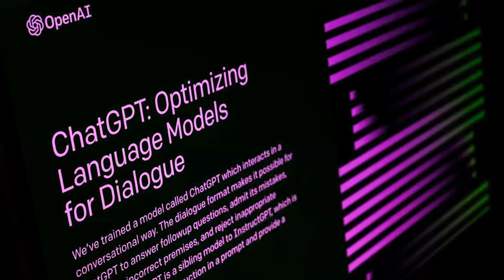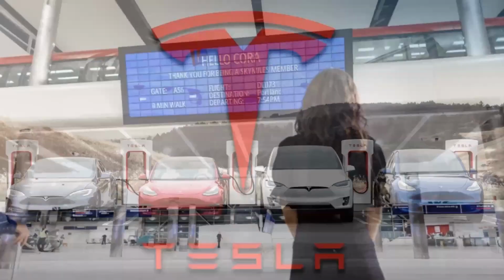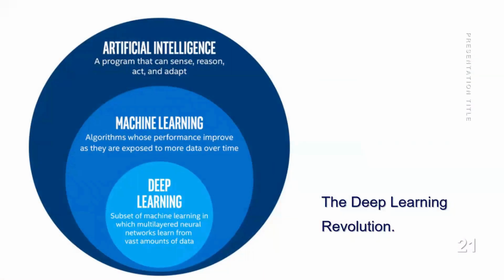So where do we go from here? The answer involves this, and this, and this. So each of these examples rely on deep learning, as do most new attempts at automatic cephalometric identification. So the researchers and engineers moved away from regression models and are now building deep learning models. And so what is deep learning? It's a subset of machine learning that makes use of special algorithms called neural networks. And neural networks do this because they model the biologic system of the brain.